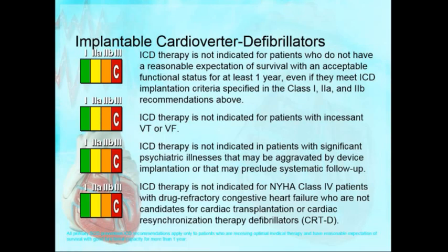I don't know whether that was a secondary prevention or a primary prevention patient. Usually for secondary prevention, we do it whether you have insurance or not, because he survived a cardiac arrest. For primary prevention, we talk with them and say there's a good chance you'll be stuck with a fat bill, and some people don't want it done. Some people with insurance also do not want a primary prevention ICD. They say, doc, I will take my chance, let me go.